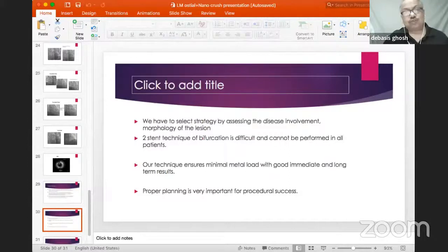Yes, I do. Only some of the stents will accommodate, and you need to really know the profiles of the stent when you're using that. So that's a planning which you need to do from before. And I would do exactly what you have suggested. I would rather go in with the 3.5, under-deploy it in the distal segment, and then try to achieve a 4.5 in the left main stem. I think there are very few left main stems which are actually 4 and below.